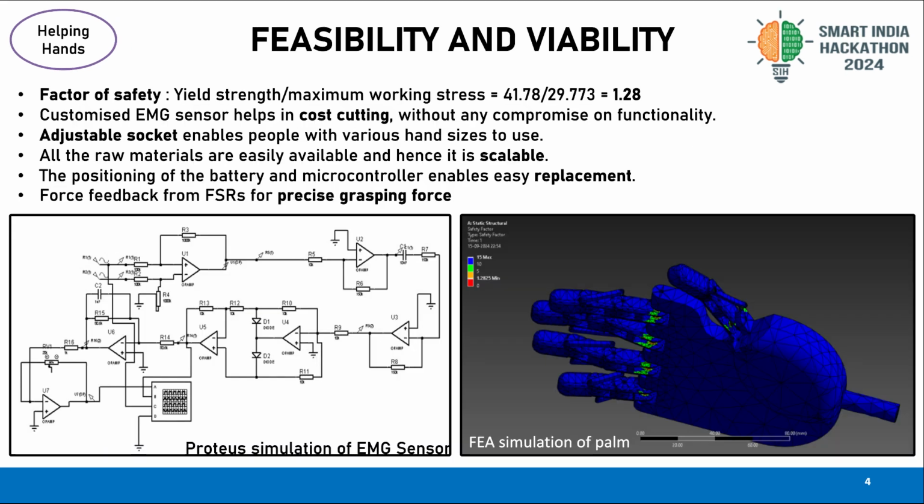So moving on to the EMG sensor part, EMG sensors are one of the most important parts of this prosthetic arm. The EMG sensor detects the signals of muscle contractions to predict the motion of the hand. Main functions of these EMG sensors include detection of signal, amplifying the signals from the range of millivolts to a higher voltage range for further actuation purposes, along with noise reduction and rectification. Each EMG sensor comes with 3 electrodes, namely 2 recording electrodes and a reference electrode. In our prosthetic arm, we decided to use 6 sensors to detect the most precise signals.